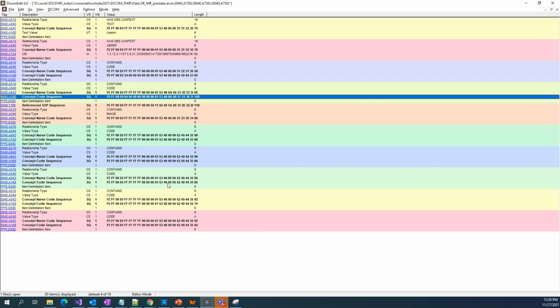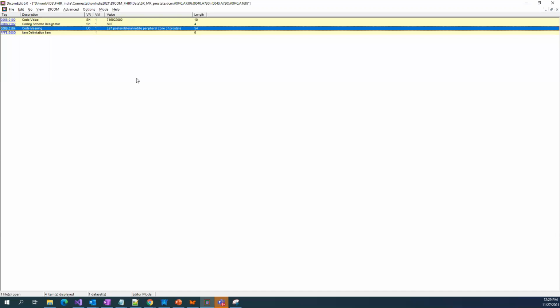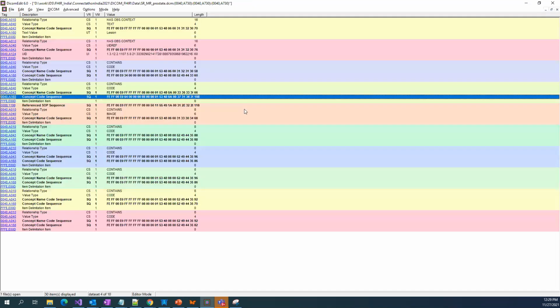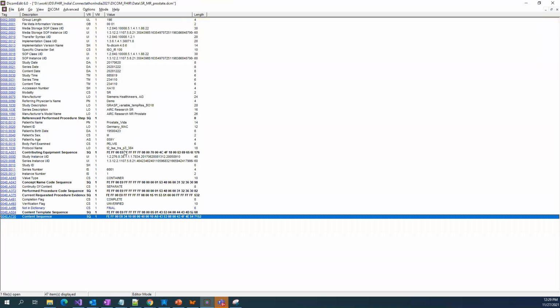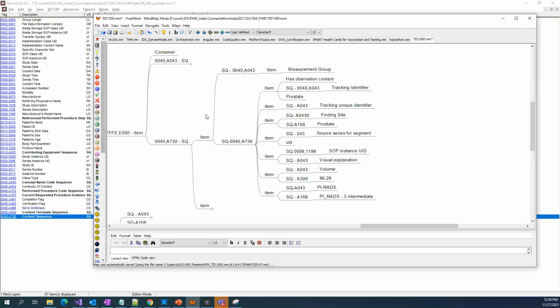What we are going to do is convert this DICOM SR into a JSON. We are going to write a translator which will convert these things as observations, and finally we store that information as FHIR observation. So the whole exercise is about this. You should be aware of how to read this DICOM SR file, and to read it you should know what TID 1500 is.